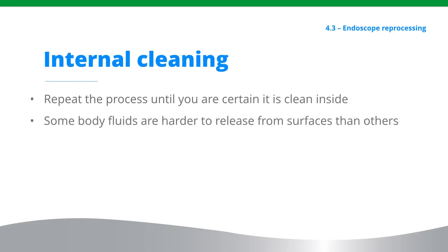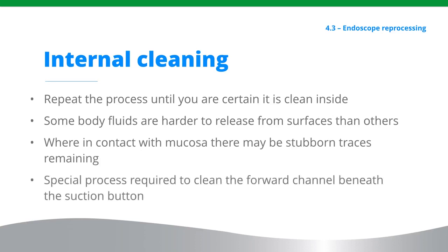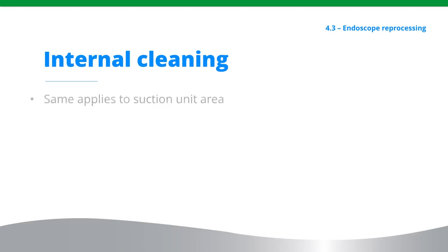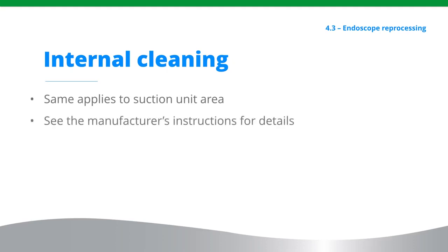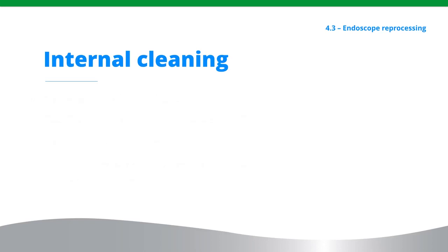Some body fluids are harder to release from surfaces than others. Where an endoscope has been in contact with mucosa, there may be stubborn traces remaining. A special process is required to brush clean the forward channel beneath the suction button. The same applies to the suction unit area. See the manufacturer's instructions for details. With the biopsy port cap and button reconnected, connect the suction system to its port and turn on, or use a large syringe and tubing.